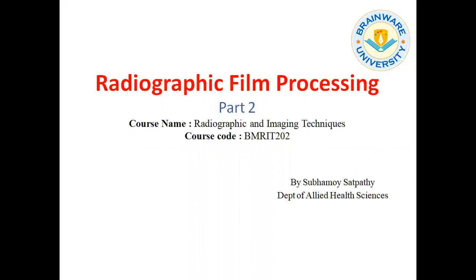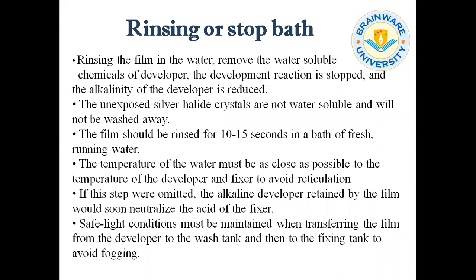So after development, rinsing or stop bath plays an important role to remove the developing chemical from the film surface. The water soluble chemical of the developer will be washed by the rinsing water. The unexposed silver halide crystals are not water soluble, so they will not be washed away.